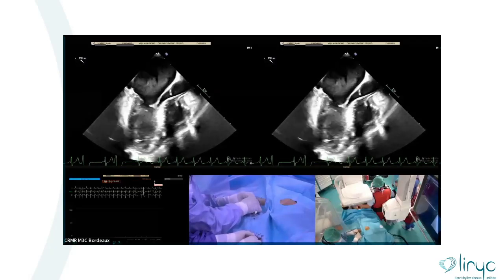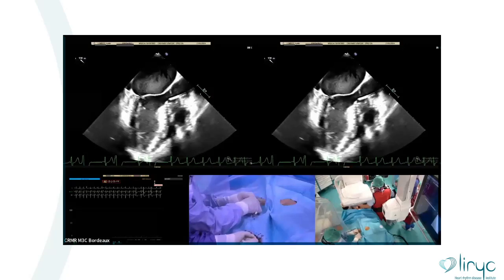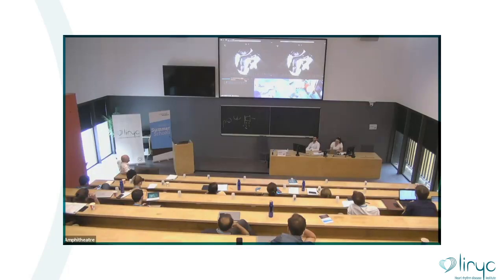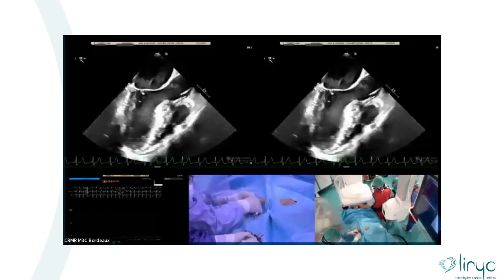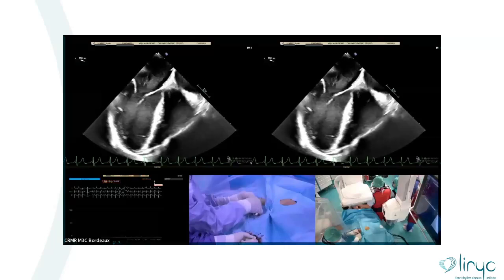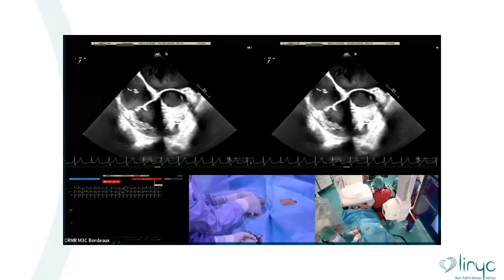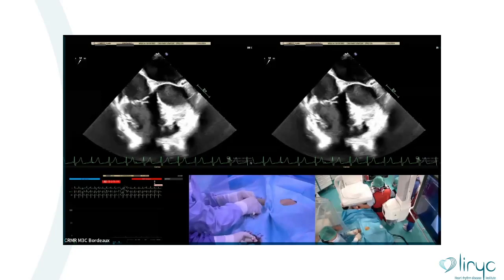Yeah, very close. Very close. And pull back the whole system. Pull back a little. No, I think we are back in the aorta, long axis. Okay, sorry, guys.